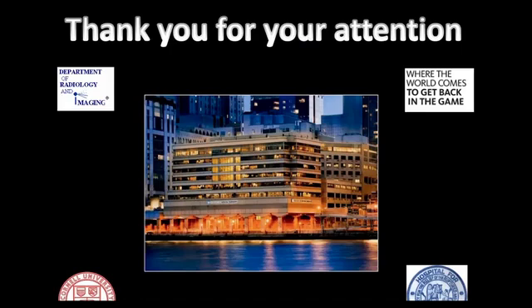With upright MRIs, the trade-off is sometimes in image quality. They tend to be midfield magnets, 0.5 Tesla, so if you're trying to improve your image quality, your acquisition time is longer. It's actually hard to stand or sit still for a while. Everybody has sway, as I'm told from our biomechanics lab, and I think sway plays into that. I think the current install base of MRIs, where you're doing it for spines and brains and knees and all other stuff, outweighs having a specialized unit for that.